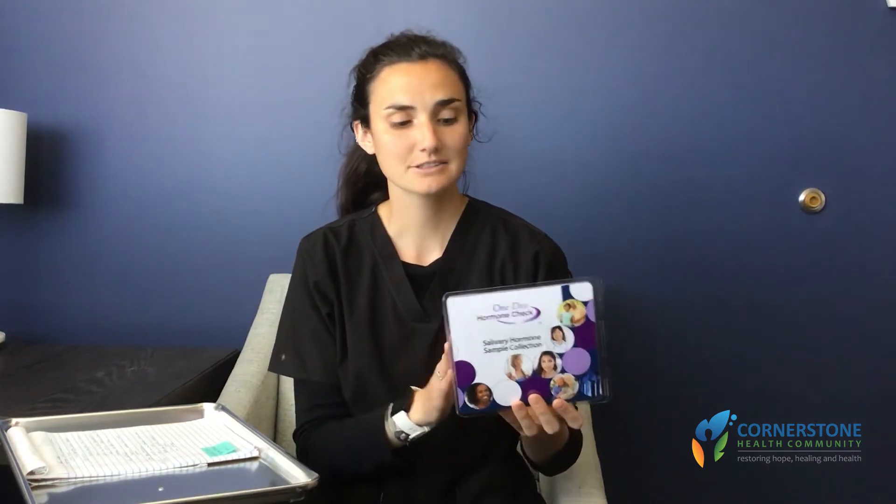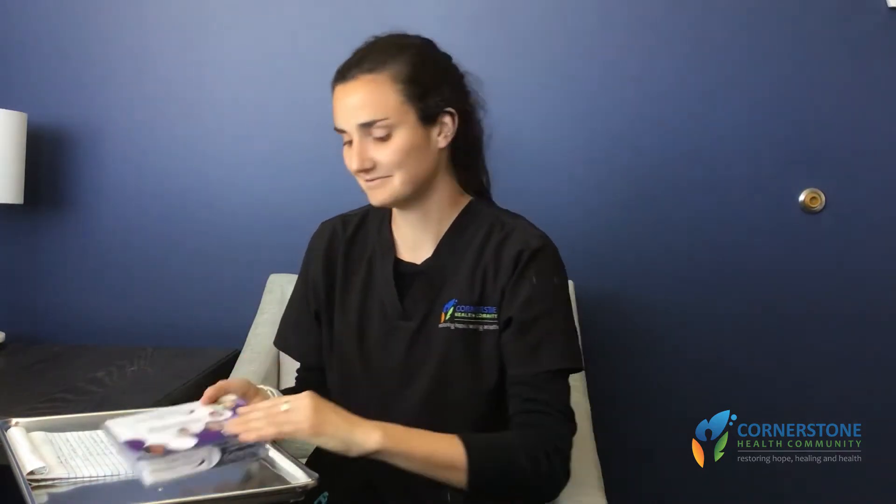Hi, it's Jules from the lab, and today we're going to be discussing our one-day hormone salivary collection kit. To start, let's go over what's inside. Our first paper is the requisition form, which we'll go over later. The second piece of information is the instruction sheet that comes with the kit — we'll touch on these, but you will need to read them in full before beginning.